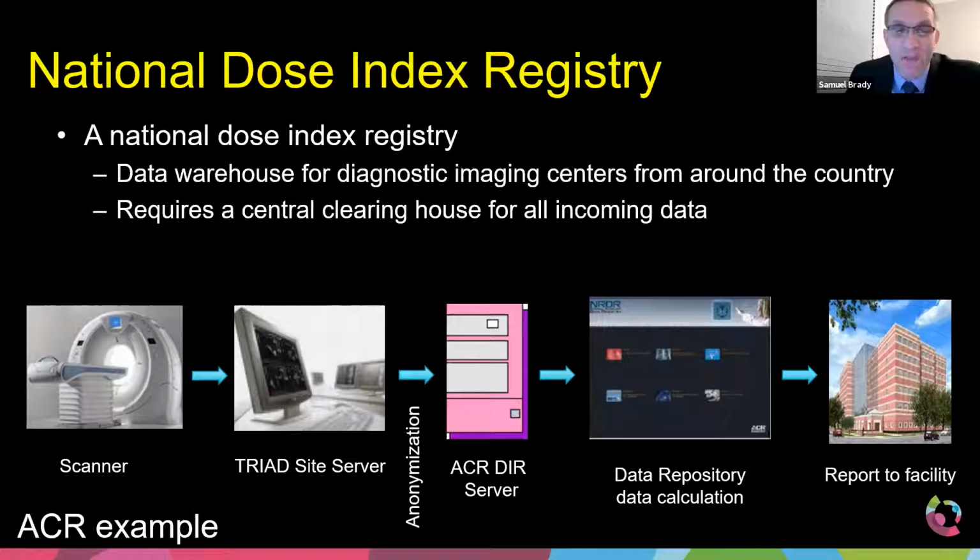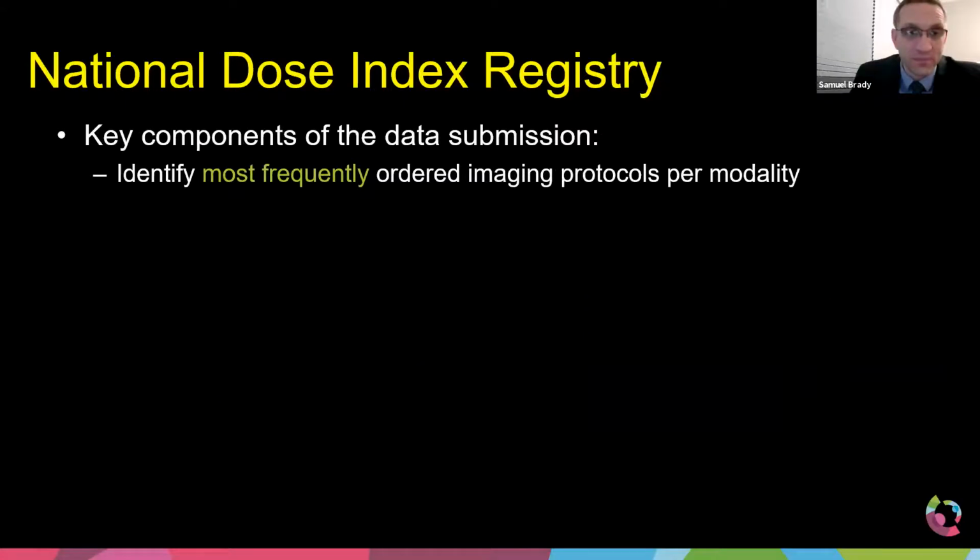And once it arrives at the main repository, it's going to collect in a server, and that server then will be accessed by the staff that will look at, collect the data, and make their calculations. And then ultimately that staff will generate the reports, the national levels, and then they can send out other reports to the hospitals, which we'll talk about in a moment.